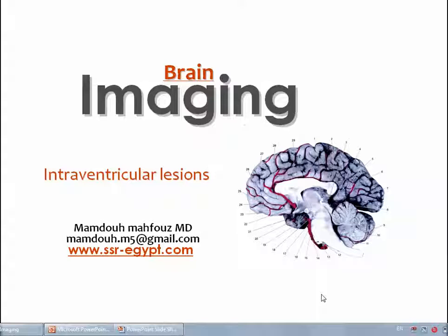Dear colleagues, this is lecture number 6 in the series of Diagnostic Radiology in English, DRE, and we are handling the subjects of brain imaging. Now we will talk about the intraventricular lesions.